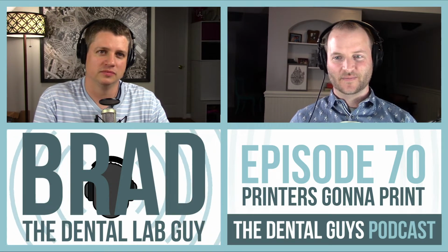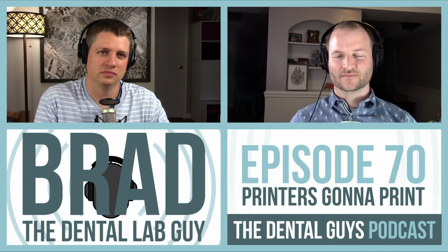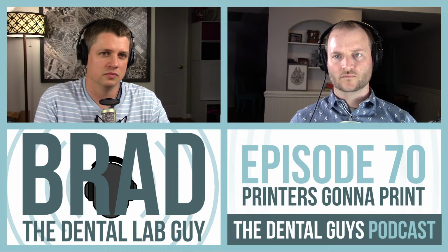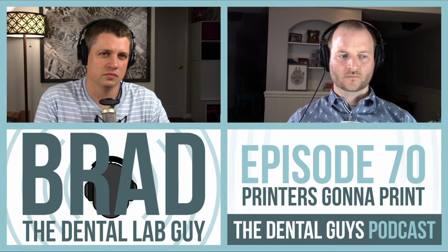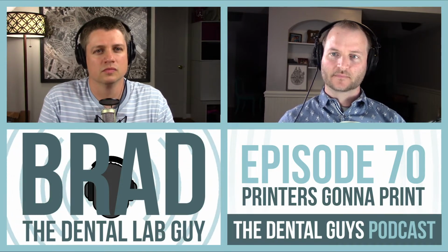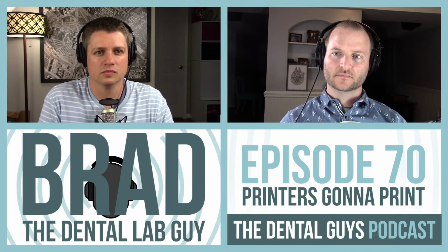Well, we could have too. I could print models on day one, but it wasn't a model I was after. It was the tolerance, the accuracy that I was after. And that took us a while to tweak and change. We had to learn the scaling factor of the unit, and then we had to design some different artifacts. We actually calibrate ours daily. We print an artifact on the printer plate at the same time we print the models, and then we measure that to make sure it has accuracy.